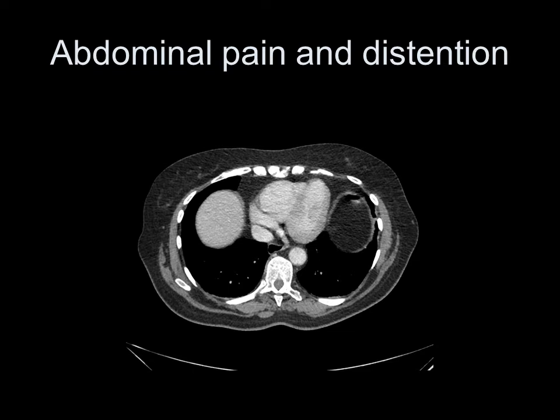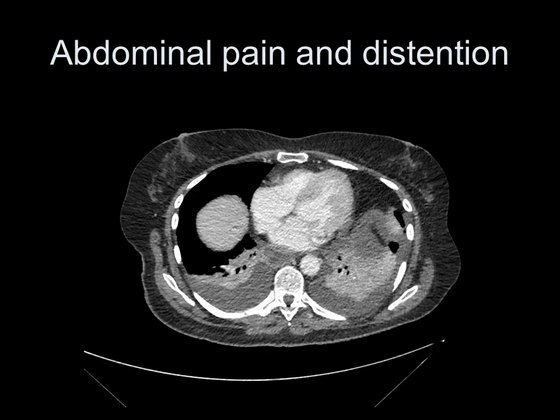Here's another patient who came in with abdominal pain and to deal with their abdominal issues, and here's a repeat scan on the 22nd of January. Again, this time we have bibasal atelectasis with pleural effusions. There was no specific reason found for these. It's not as though the patient had extensive ascites in the abdomen. The rest of the images, this is just a process which patients tend to get when they're lying down all the time in hospital. I can't say that it's usually as extreme as this just from the act of being in hospital, but I don't think I would describe this as consolidation. I would describe this as bibasal atelectasis.